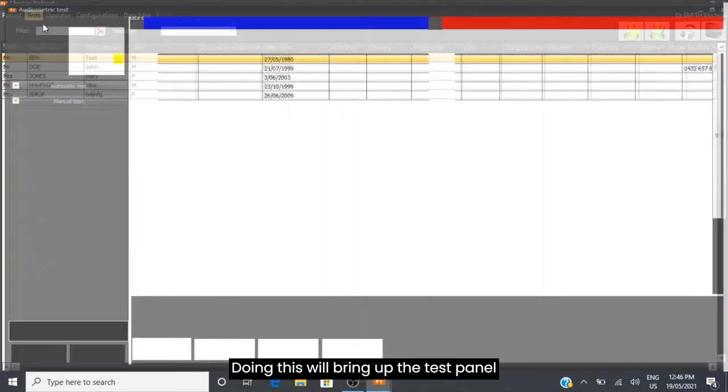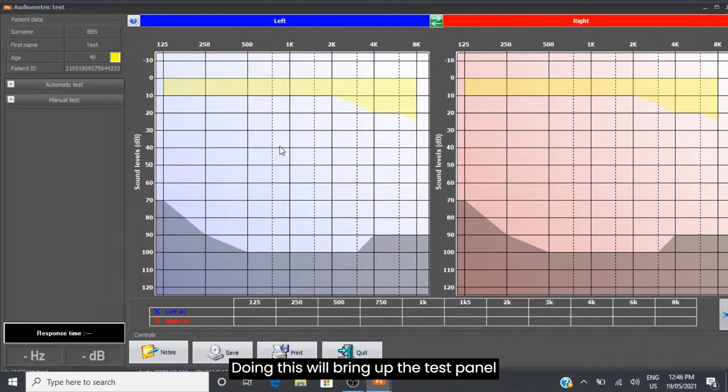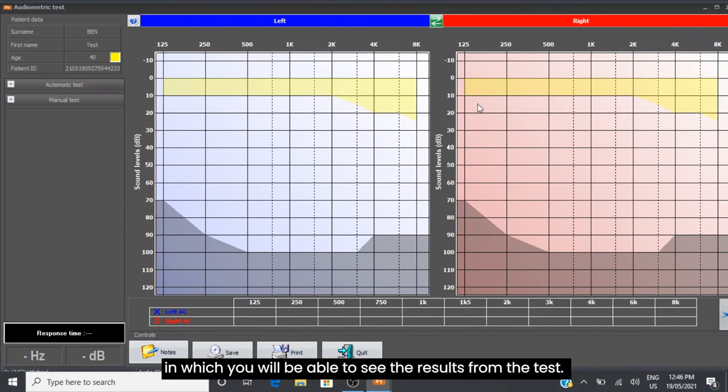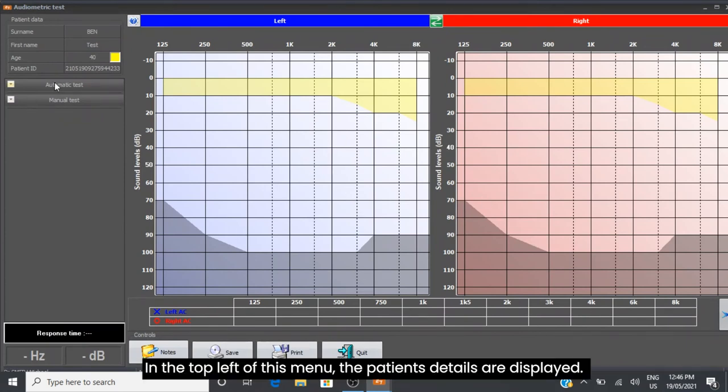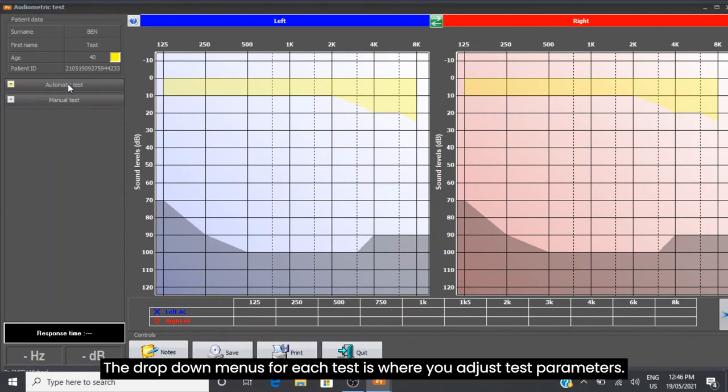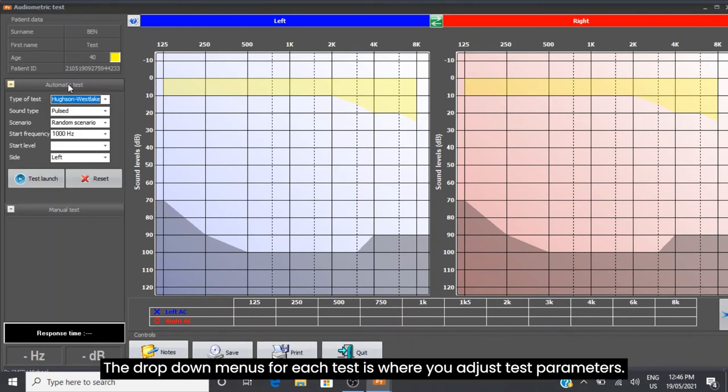Doing this will bring up the test panel where you will be able to see the results from the test. In the top left of this menu, the patient's details are displayed. The drop down menus for each test are where you adjust test parameters.